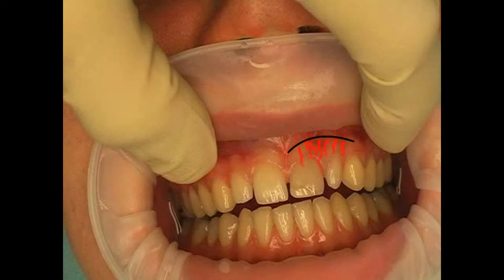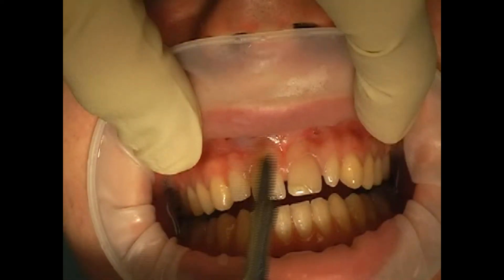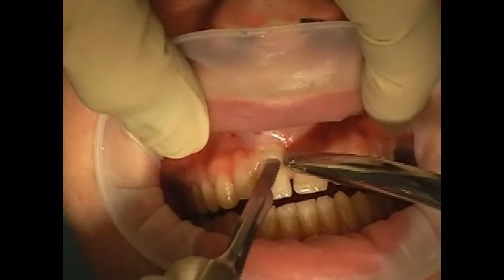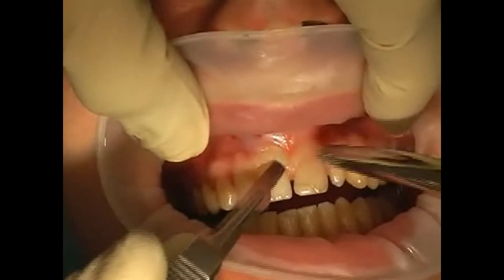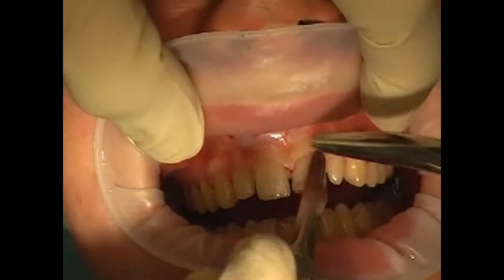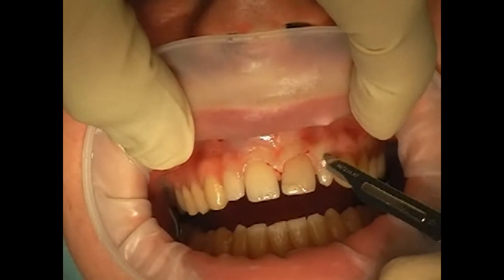A smooth wound healing process requires blood. This is why a different type of incision, in this case the gingival margin cut, was used. You see how the scalpel is carefully inserted between the tooth and the gingiva. By means of two vertical relief cuts, the oral mucosa can be easily moved to the side.